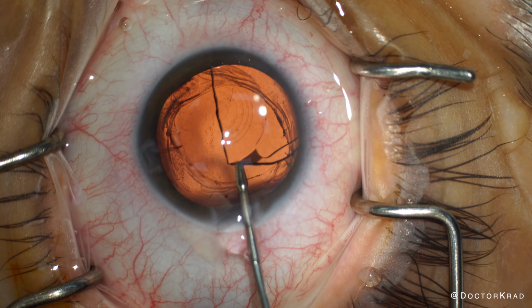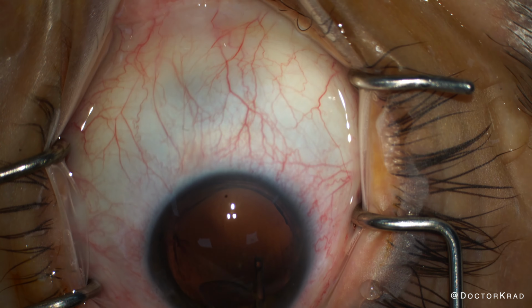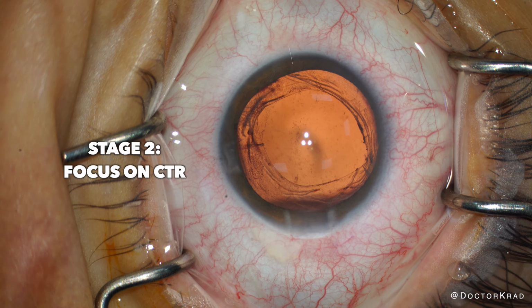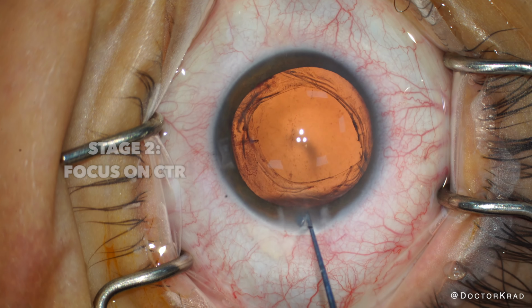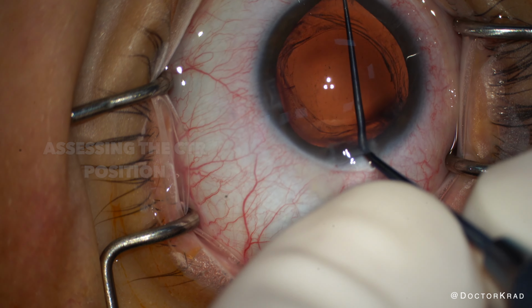This patient was a high myope, so there's a lot of space in the anterior chamber, but you do want to make sure that the capsule is inflated and the posterior capsule is away from the action. All right, so now on to the CTR. Where is this thing? I'm using a Kuglin hook.